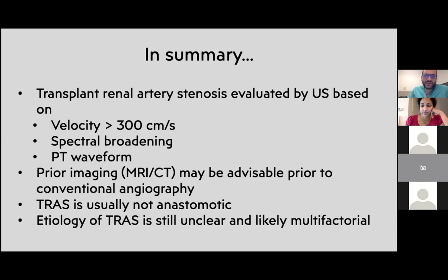That diffuse stenosis that I was showing, even though it might show up and be visible on angiography, is not treatable. There's nothing they can really do to treat those particular types of lesions. So I do think ultrasound contrast has a role, and it can be used from institution to institution, but I think MR with ferumoxytol would be a better gold standard.